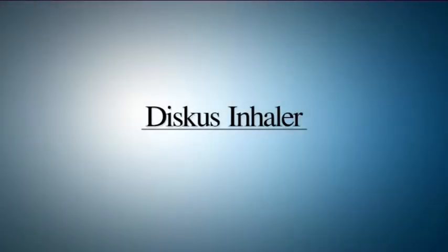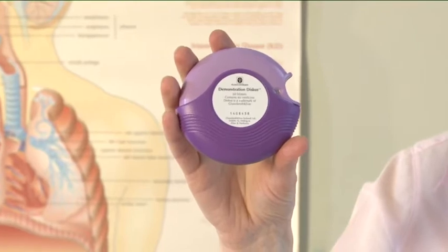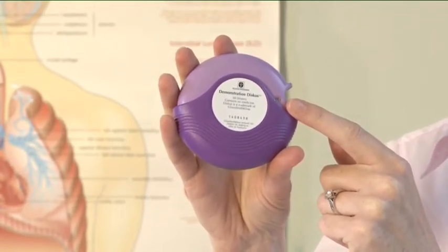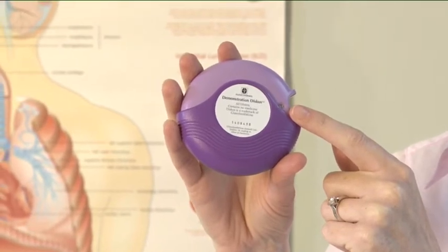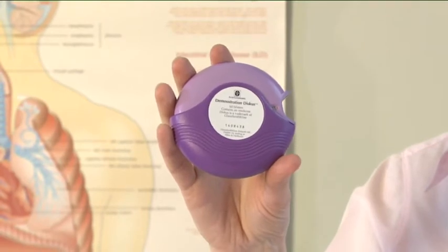Discus inhaler. The discus device holds blisters containing medication as a powder. There is a counter on top of the discus which tells you how many doses are left. It counts down to zero. The numbers five to zero will appear in red to warn you when there are only a few doses left. Once the counter shows zero, your inhaler is empty.